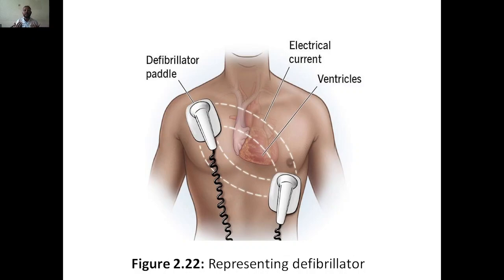So when they start, this beating heart is beating because of the electrical impulse. When there is an electrical problem, the heartbeat is reduced. So we are going to give an external electrical impulse or electrical current, so that the ventricles start contracting, which can give you the heart rhythm or heartbeats. Okay, that's how we are going to save the particular person.